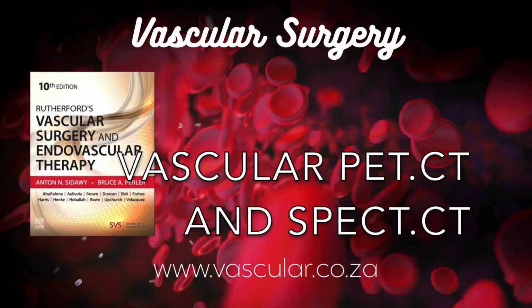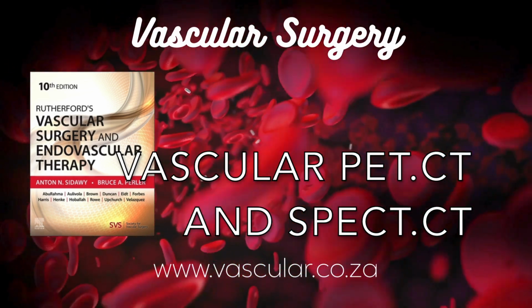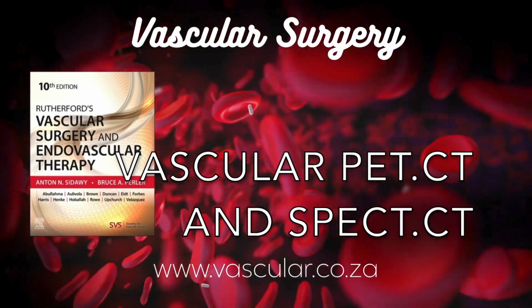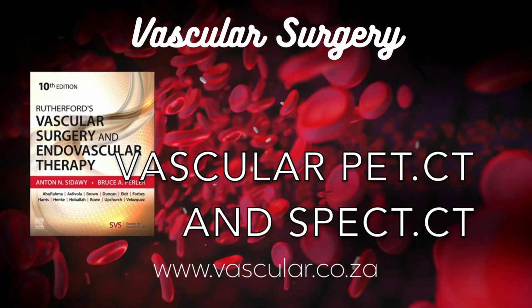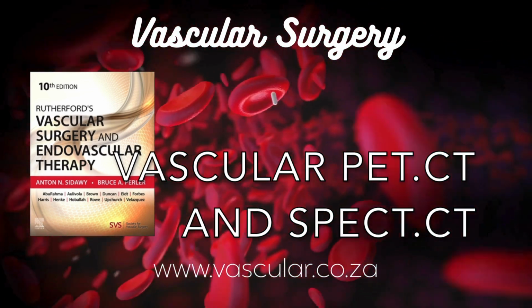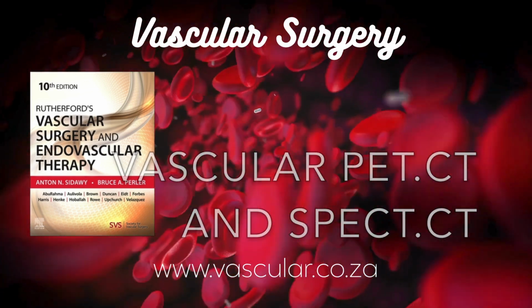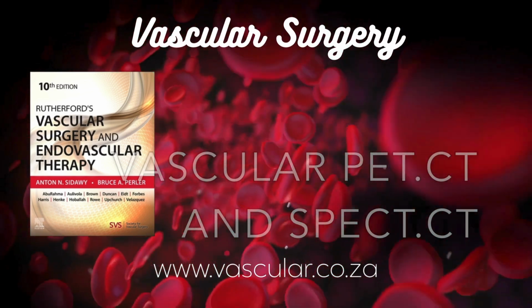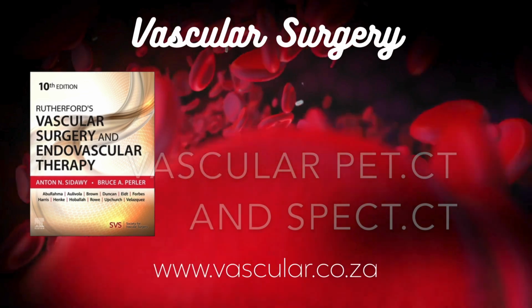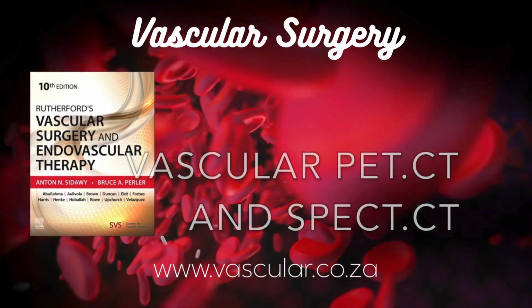And the hybrid SPECT/CT aspect is important for WBC scans too. Hugely important. Just like with PET/CT, adding the CT to the WBC SPECT scan allows precise anatomical localization. You can see definitively if the white cells have accumulated on the graft or just nearby. Improves confidence and helps define the extent of infection. Okay. What about FDG-PET/CT specifically for graft infections, strengths and weaknesses? FDG-PET/CT is very sensitive. It's good at picking up infection if it's there, but its specificity might be a bit lower than WBC, especially soon after surgery.